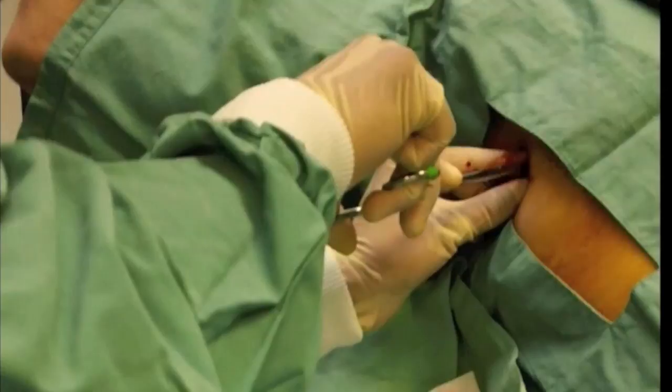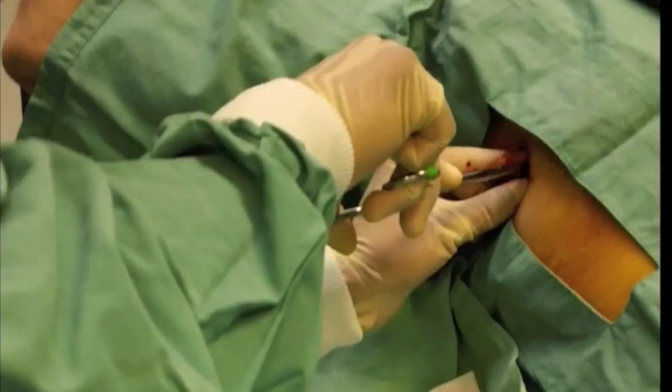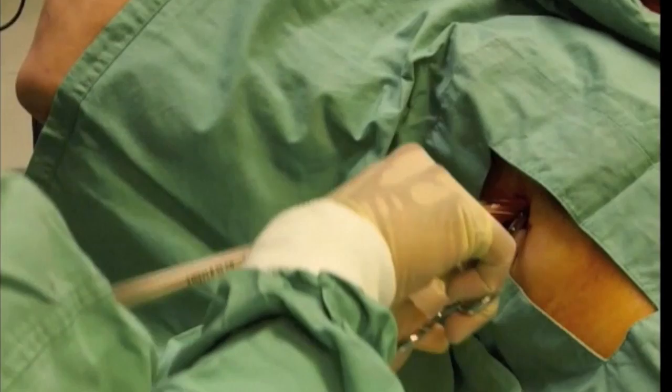Push through the intercostal muscle and open the tract to the size of the tube. Keep your position with a finger, then push and position the tube — often directed posteriorly and superiorly.